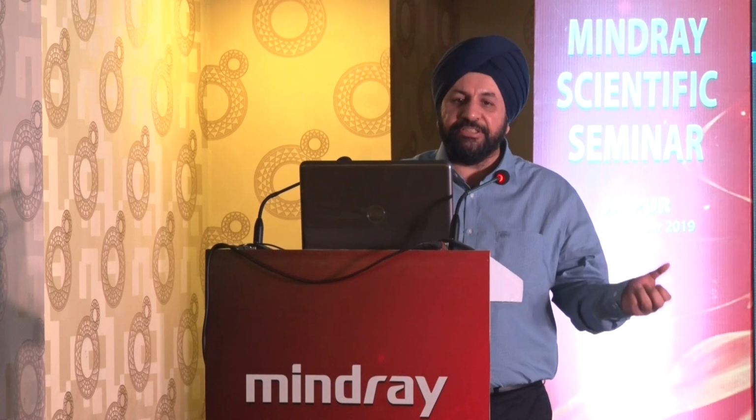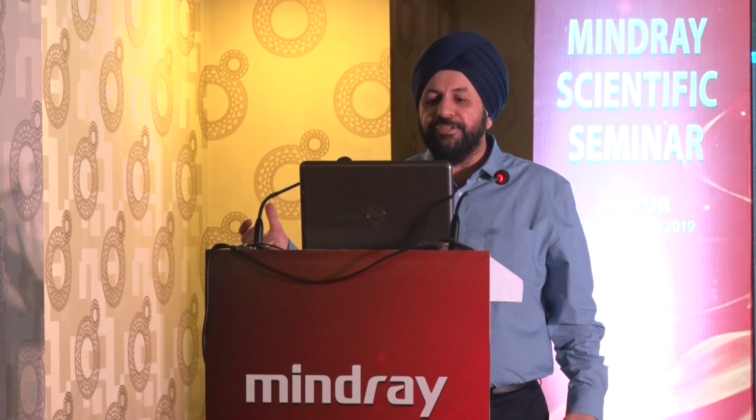Most of these analyzers now have something called the switching algorithm, where the analyzer decides, based on certain parameters, whether an impedance is more suited in this condition or an optical platelet is more suited. And then we have something called the platelet HFC ratio, which is similar to PLR, but these markers also have additional prognostic significance in dengue, as we'll discuss later. We have something called the high fluorescence IPF. So within the IPF, we now have a high fluorescence region, which is called high fluorescence IPF.